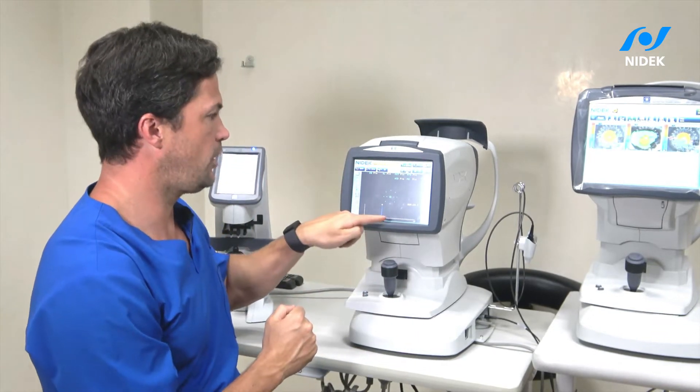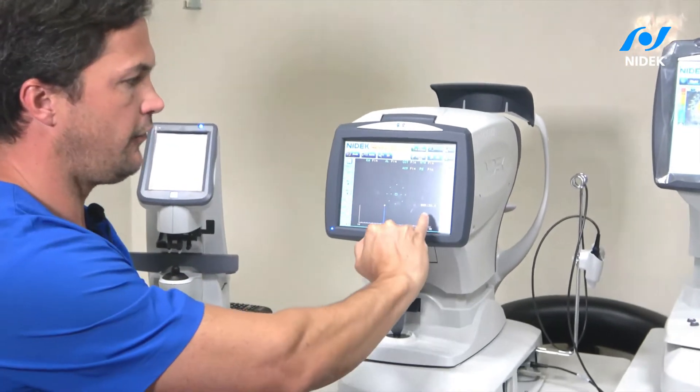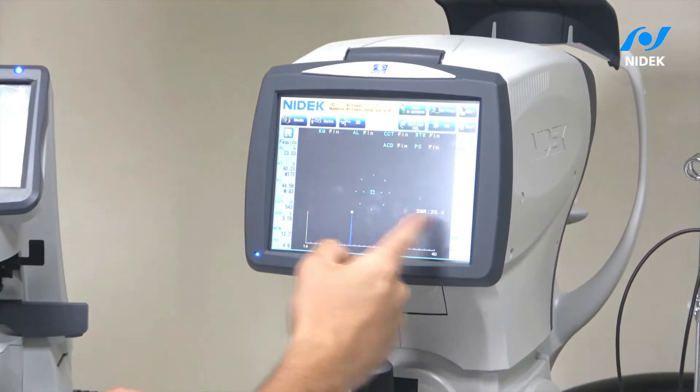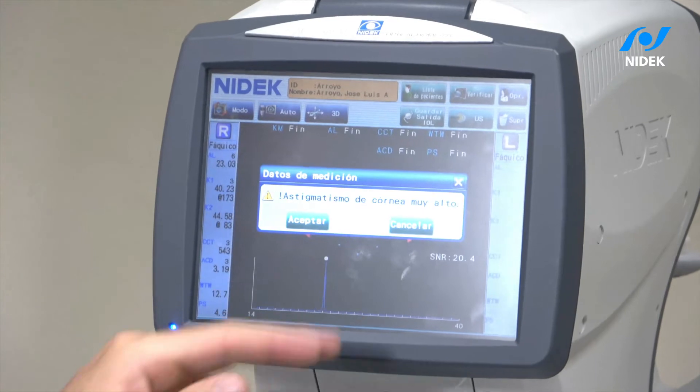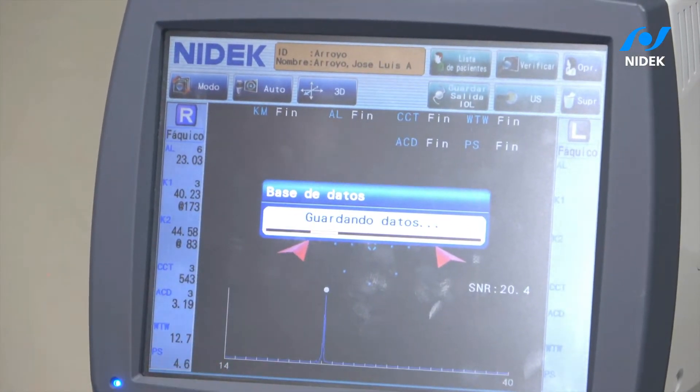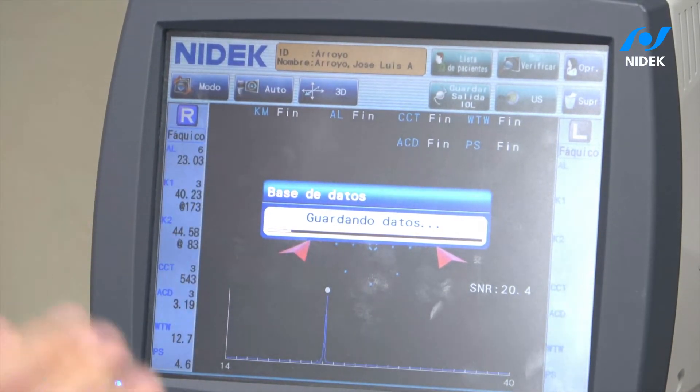It's very important that when I do the measurement I already know if my measurement was correct. The standard deviation and what I put to calculate the intraocular lens is telling me the astigmatism is high — you need to be careful. I really like that. The machine is improving my mindset on how to reason.